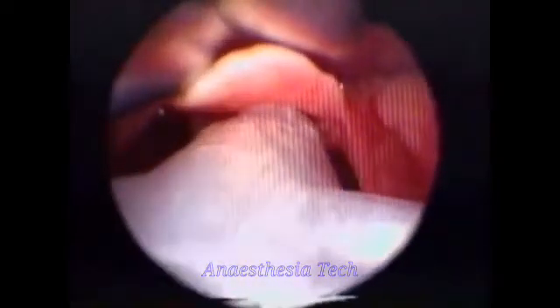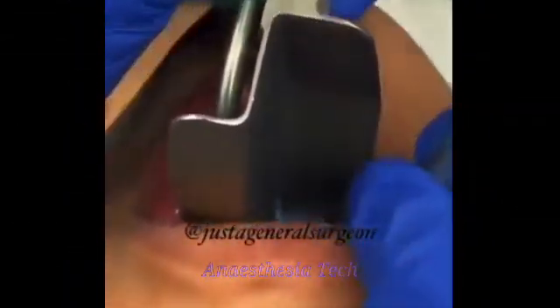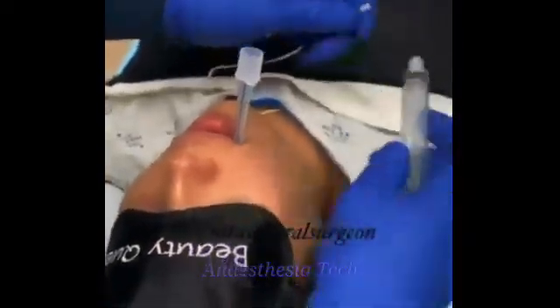Advance the tube from the right side of the mouth, keeping the glottic opening in view. Tip the tube up and in. Advance right through those cords and put the endotracheal tube in there. Carefully watch the teeth — don't get that metal against the teeth.